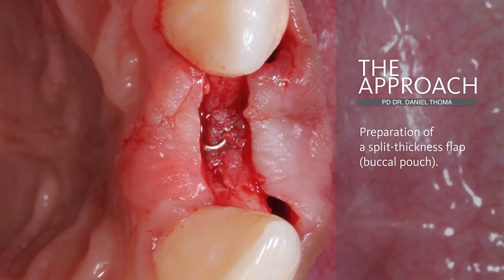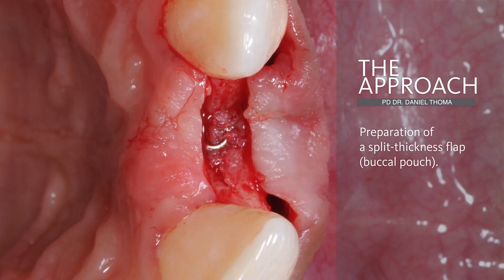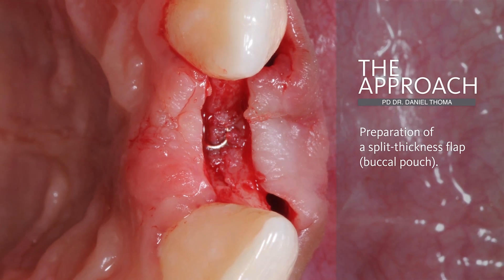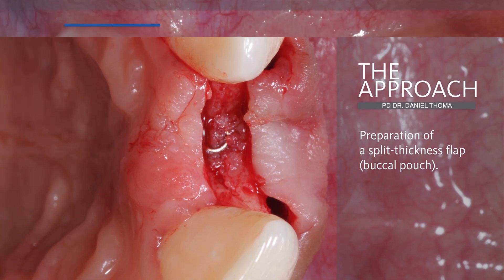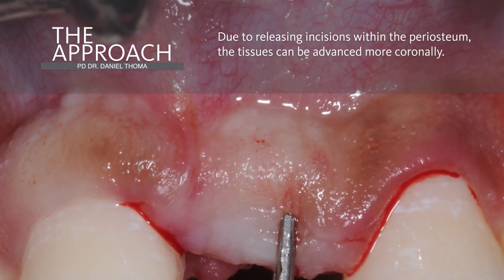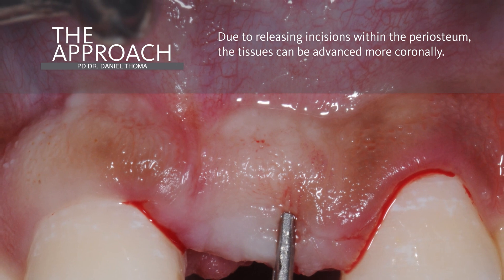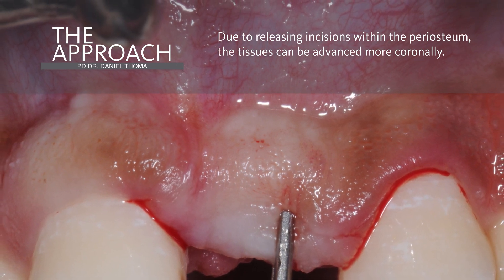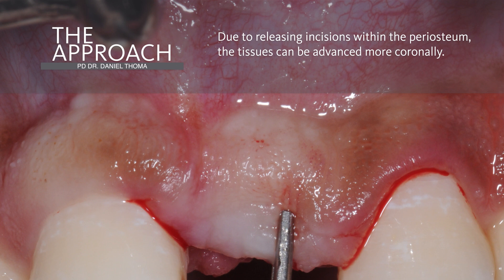As a first step to perform the soft tissue grafting procedure, a split thickness flap is prepared crestally on top of the implant, but also on the buccal side. Following the preparation of the split thickness flap, and also due to the releasing incision in the periosteum, we are able to advance the flap more coronally.